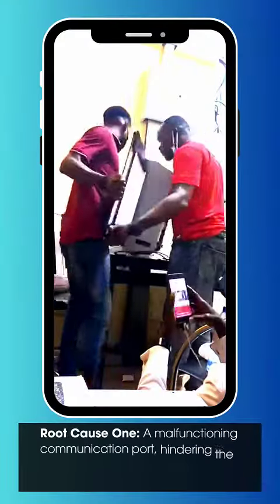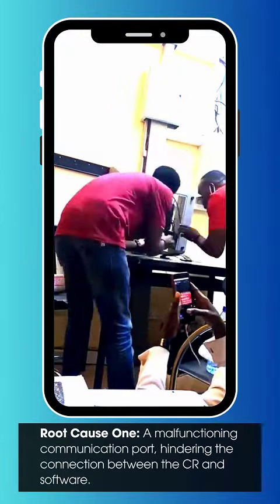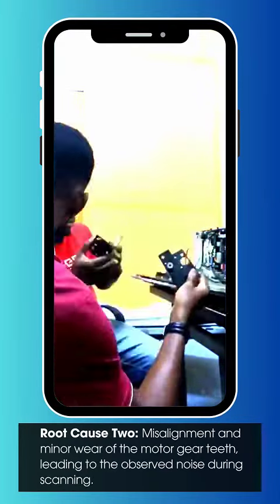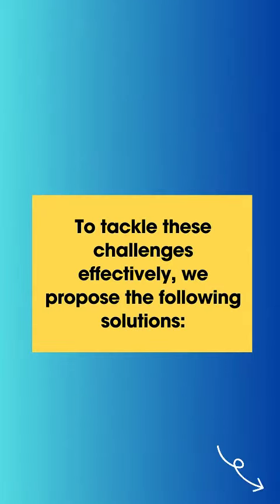Root cause 1: a malfunctioning communication port, hindering the connection between the CR and software. Root cause 2: misalignment and minor wear of the motor gear teeth, leading to the observed noise during scanning. To tackle these challenges effectively, we propose the following solutions.